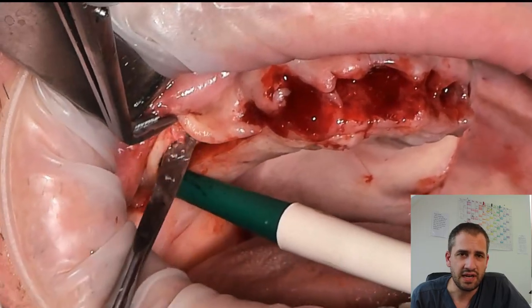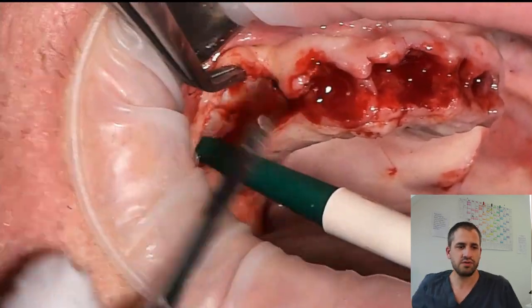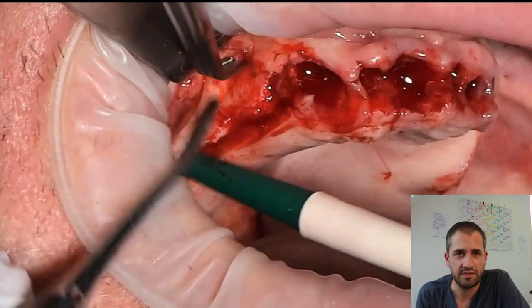You can see it's directly after the tooth extraction of the anterior tooth. At first, I release a mucoperiosteal flap.